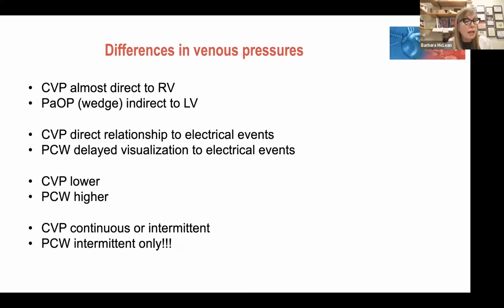Now, what they're going to say to you if you're using a PA catheter is, well, deflate the balloon. No, the balloon's not inflated. The catheter has just migrated forward, and it often does that as patients improve. As their blood flow gets better, the catheter moves forward, especially if you have a fairly large loop. And you'll hear people say, oh, he's got a large loop in the RV. Well, then just anticipate the catheter is going to get stuck in wedge.